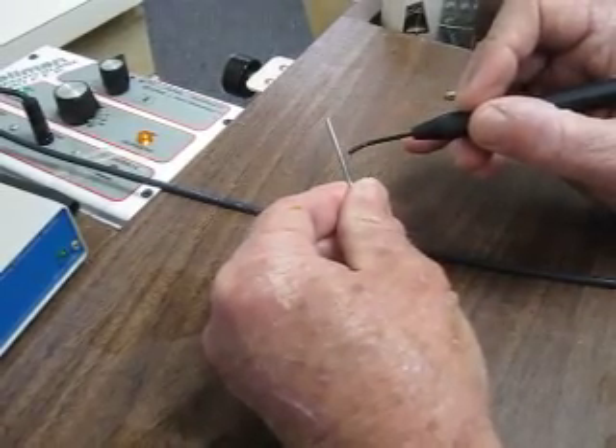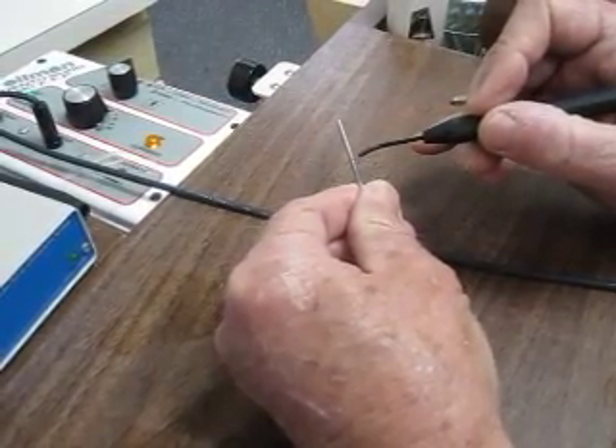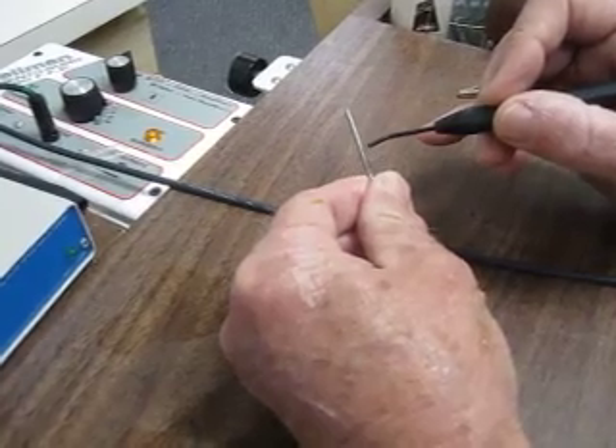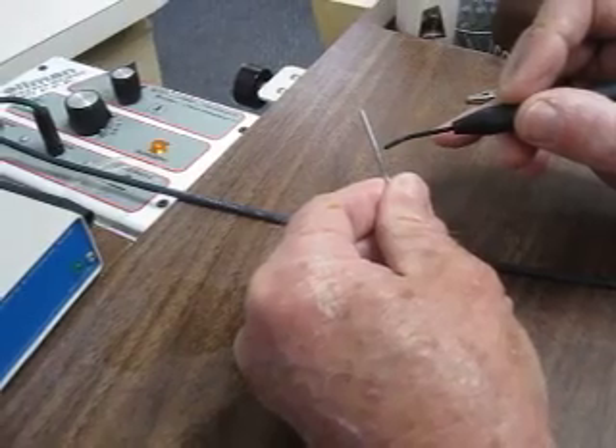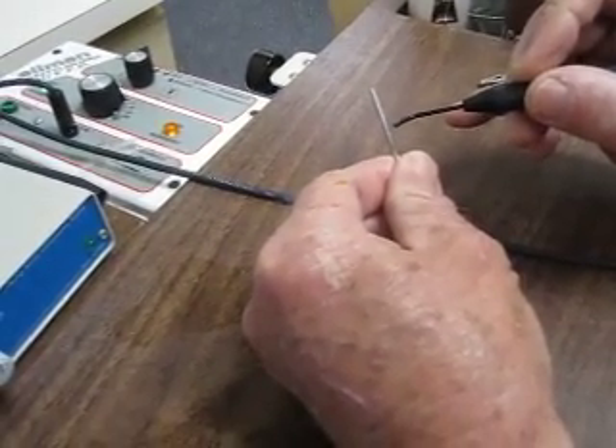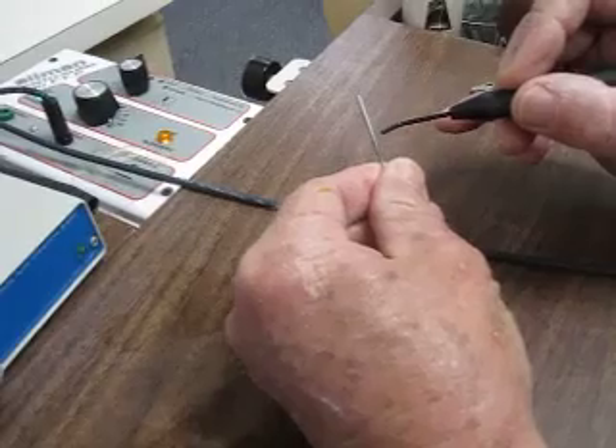Now we're going to touch the implant and you can see the sparks — see the sparks on there. I'm holding this implant in my hand. I'm waiting for it to burn the heck out of me and actually ruin it and cause major, major problems. And this thing's turned way up as high as it can go. How long am I holding on here?